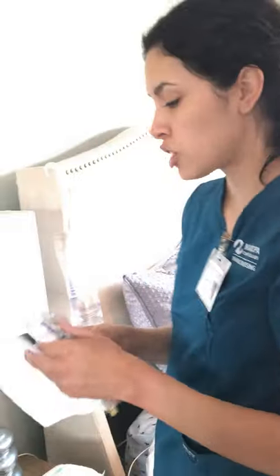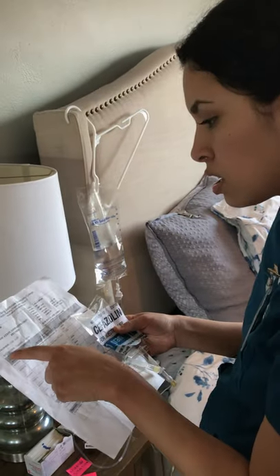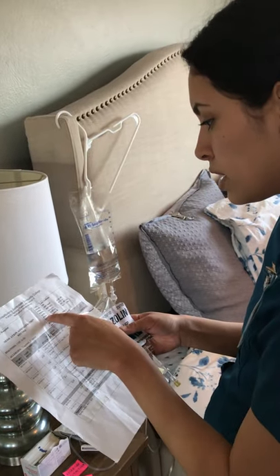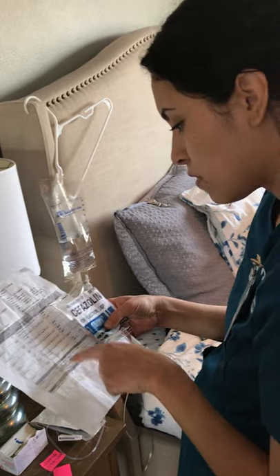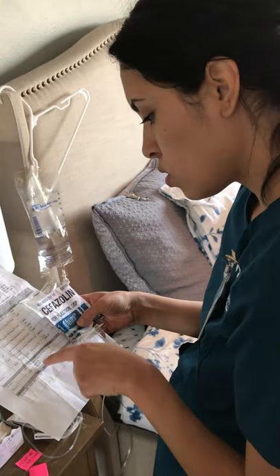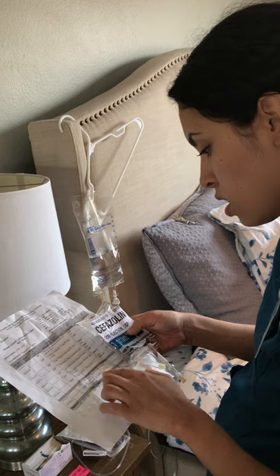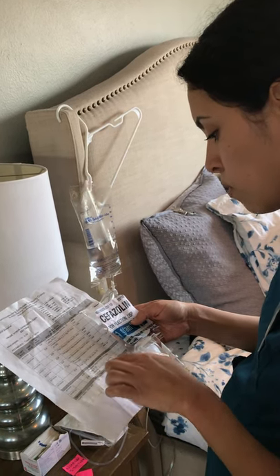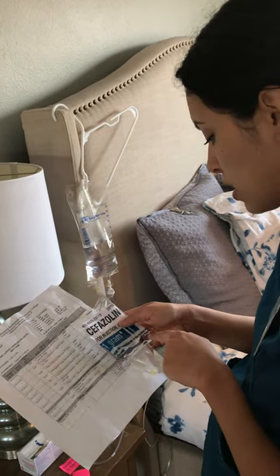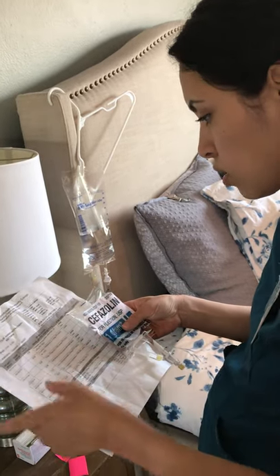Next I'm going to come to the nurse's station for my second check. This is for patient Lotta Fallings, date of birth 10/5/XX. I have Cefazolin 1 gram IV piggyback — correct route, times 1, due now, correct time, for infection. And it is not expired — expiration 2052 — so this is all correct.